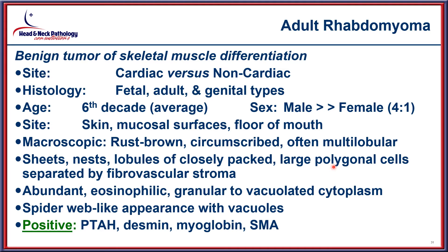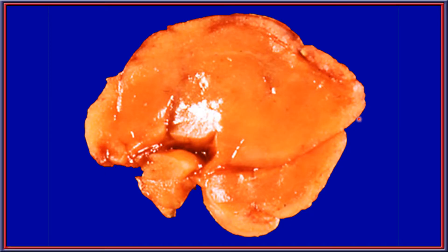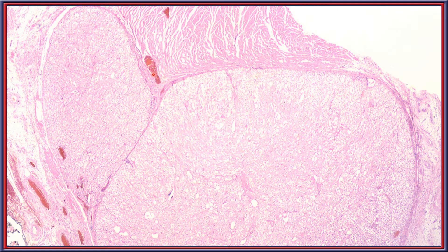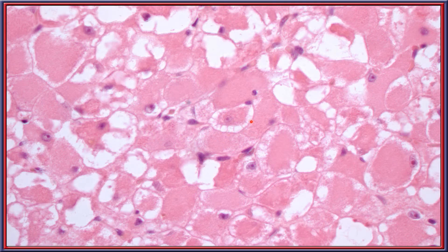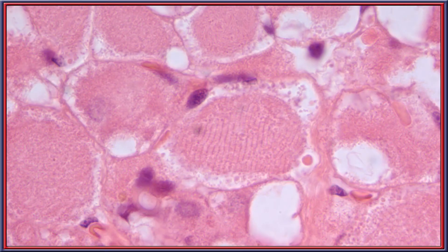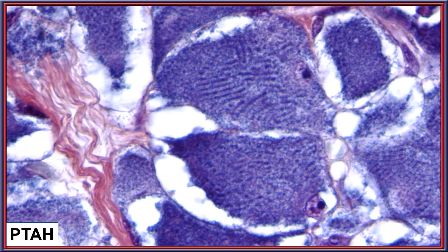Rhabdomyoma is positive with a variety of muscle markers. In the tongue, lobules of neoplastic cells are visible amid skeletal muscle. The vacuoles in the cytoplasm create a retraction artifact, giving a spiderweb-type appearance that is very well developed on high power. Cross-striations are usually easily identified as small linear appearances within the cytoplasm, and can be highlighted with the phosphotungstic acid hematoxylin stain.